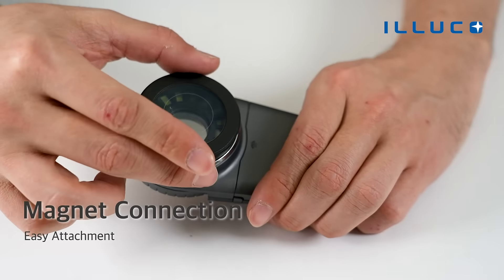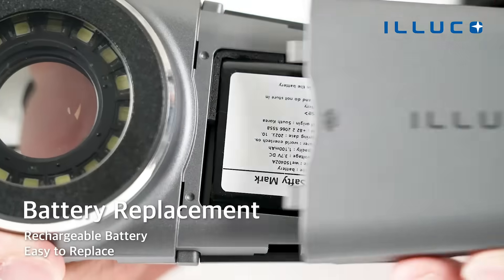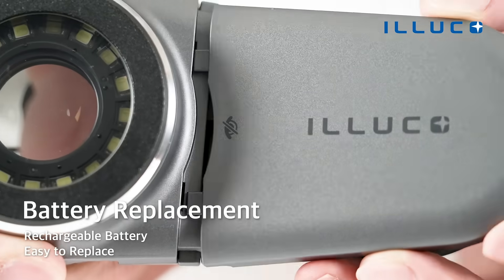IDS 1100 is easy to attach and detach parts since all connections are magnetic. The rechargeable battery enables continuous use and it can be easily replaced.